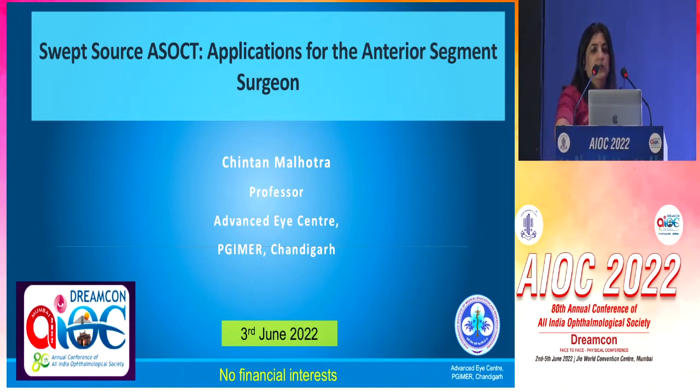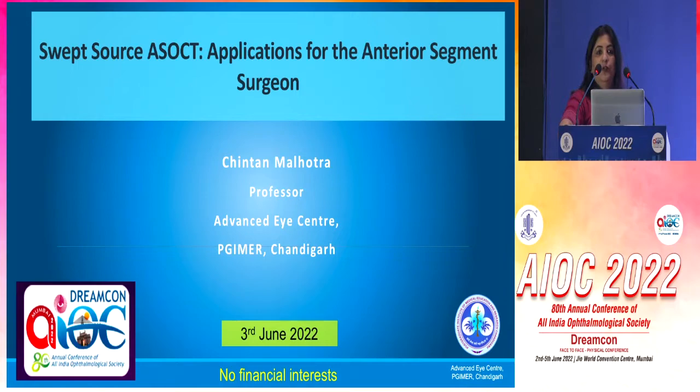Thank you, Dr. Amit, and thank you to AIOS for this opportunity, and a very good afternoon to all of you. My topic is swept source ASOCT applications for the anterior segment surgeon. At the very beginning, I would like to give a disclaimer that the swept source OCT has its uses both preoperatively and intraoperatively as well as in biometry.